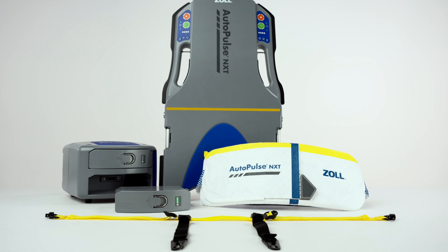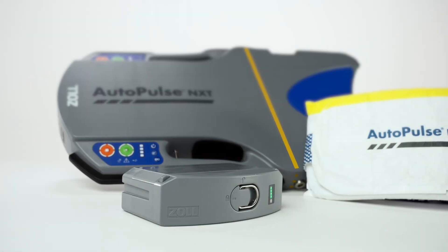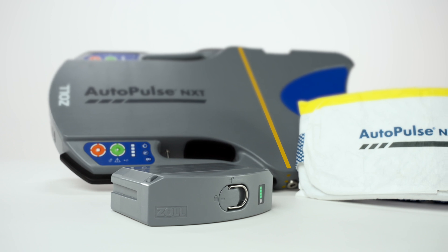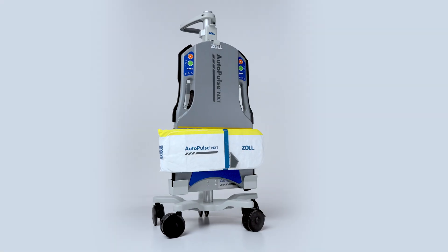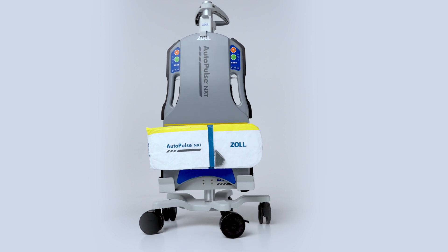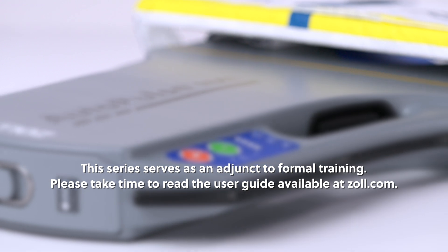Welcome to the AutoPulse NXT Resuscitation System in-service video series. This multi-part series provides detailed information about the AutoPulse NXT Mechanical CPR device and its functionality. This series serves as an adjunct to formal training.